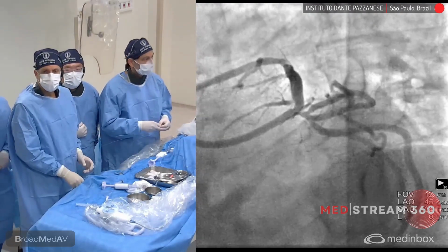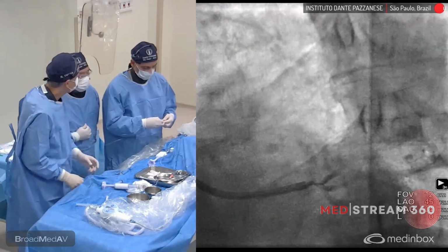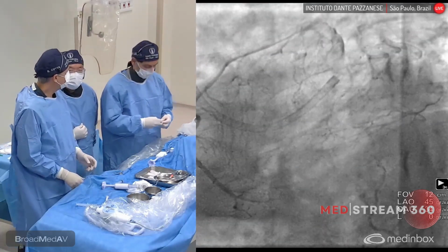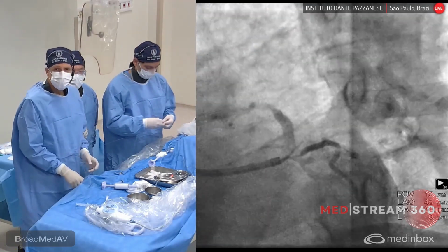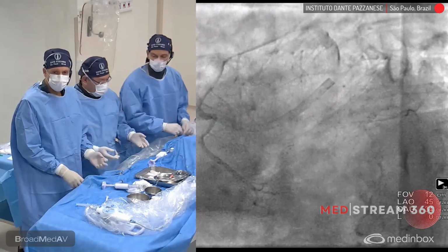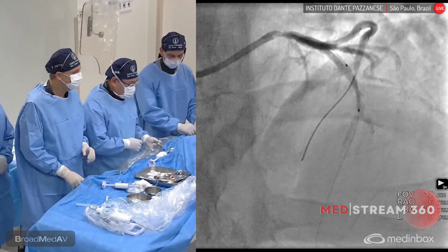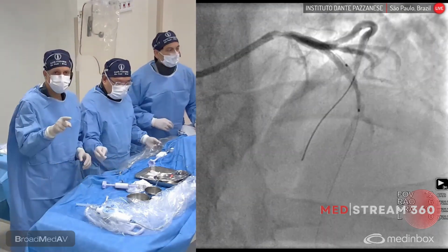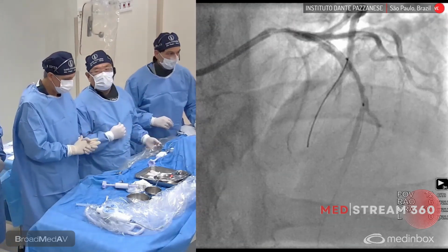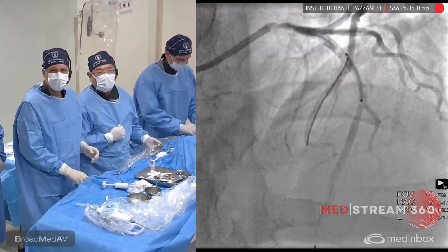And here, that's the left main. What type of guiding catheter are you using? I'm using an extra backup 7 French. EBU 7 French, okay. EBU 3, right? So really, we don't see too much backflow here. It looks to be a fully diseased left main, but with a good pressure throughout the procedure. Maybe we're going to show here a 3.5 by 18 stent, the pressure and the EKG tracing.